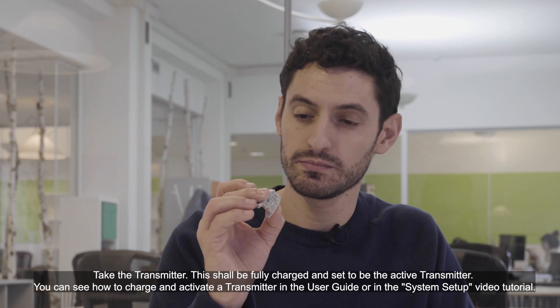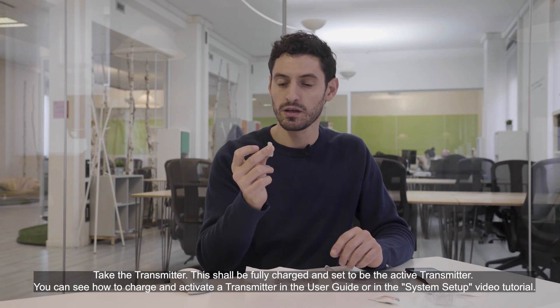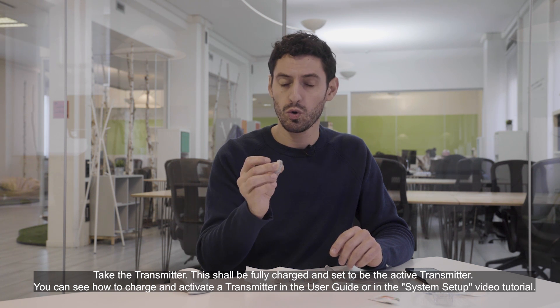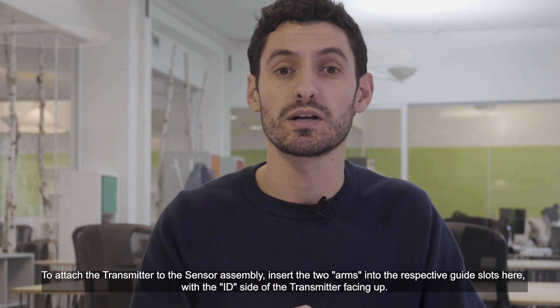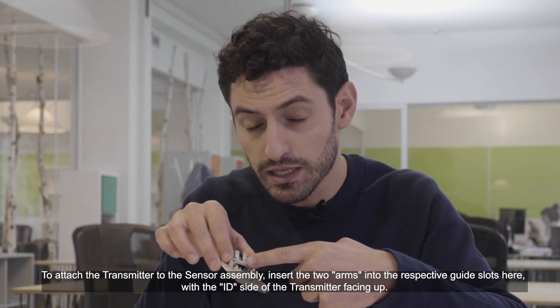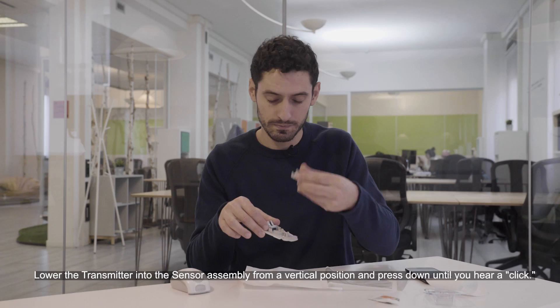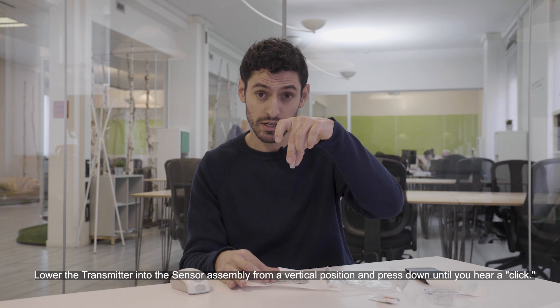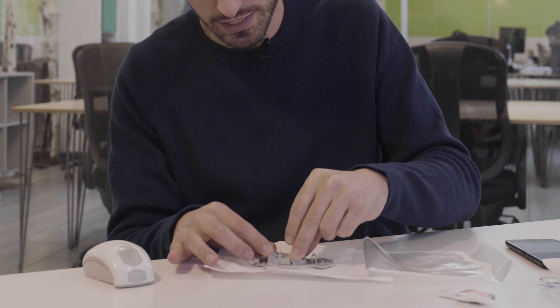Take the transmitter. This should be fully charged and set to be the active transmitter. You can see how to charge and activate the transmitter in the user guide or in the system setup video tutorial. To attach the transmitter to the sensor assembly, insert the two arms into the respective guide slots with the ID side of the transmitter facing up. Lower the transmitter into the sensor assembly from a vertical position and press down until you hear a click.